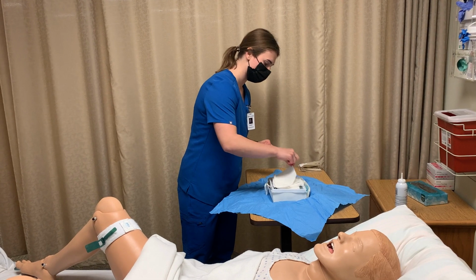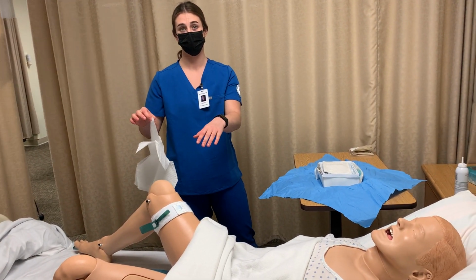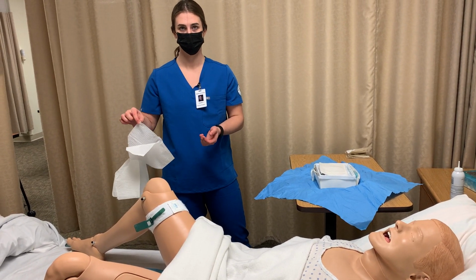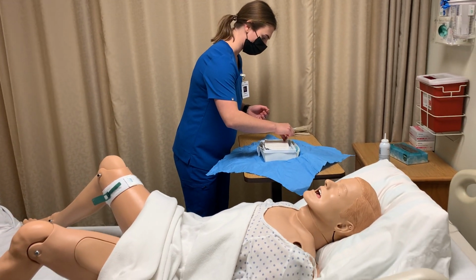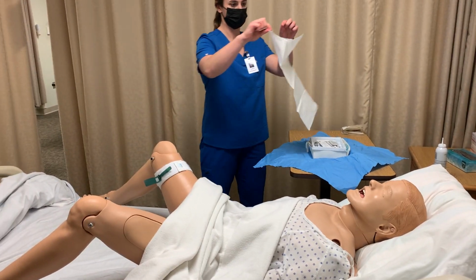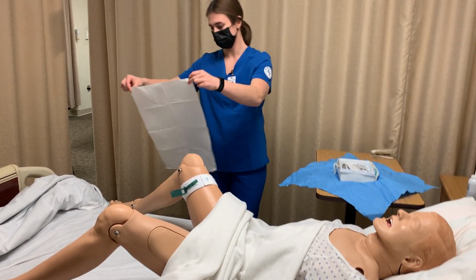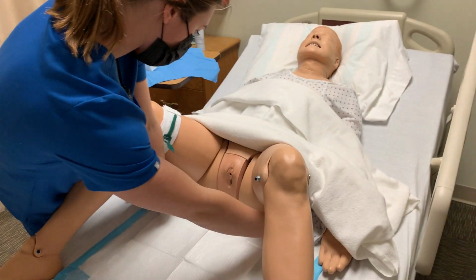Okay, so here we have a fenestrated drape. Typically we would drape this over the patient's perineum to maintain more sterility, but they don't stay up on the mannequin, so we're going to be discarding it today. Next we have our sterile drape. And I'll let that open. Place this underneath the patient.